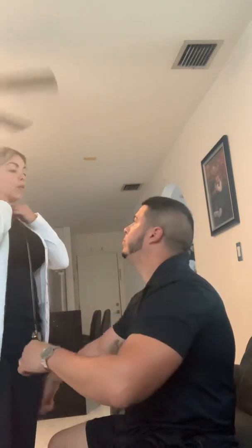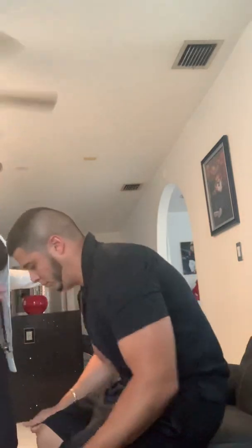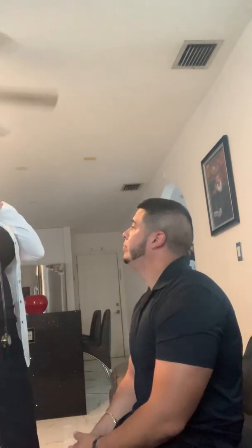Okay, so now I'm gonna perform the peripheral vascular assessment. So I'm gonna ask you some questions. Have you noticed any edema, any skin discoloration to your extremities, your arms or your legs? No. No. Okay, so I'm gonna auscultate the carotid with the bell.